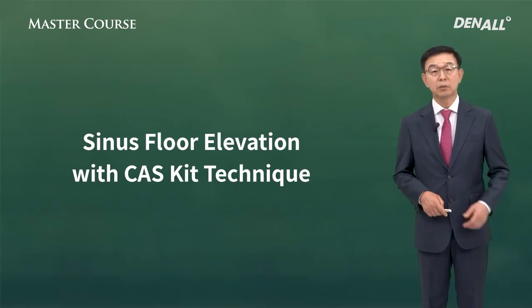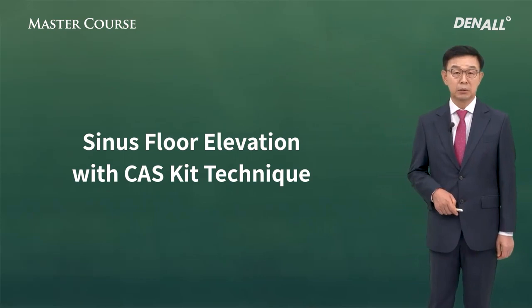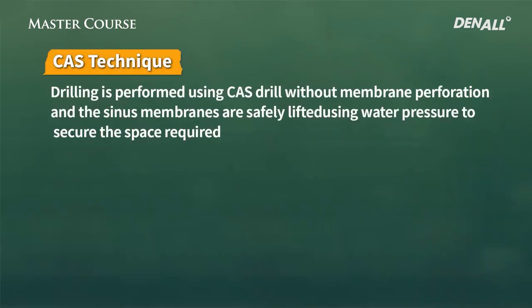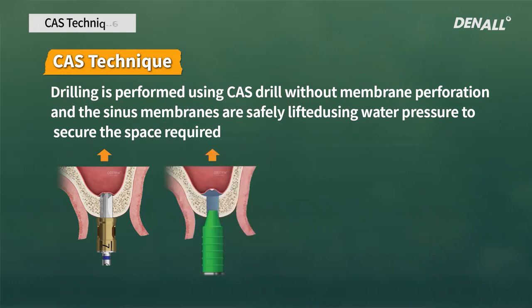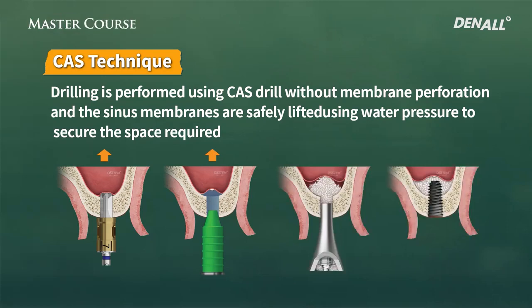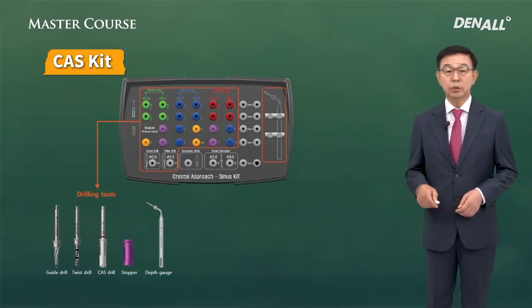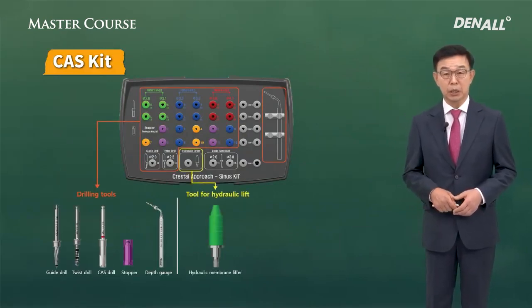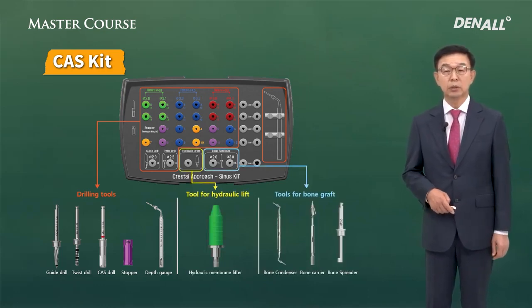The CAS technique which I'm going to mention today is an excellent way to overcome such difficulties. The CAS technique is very simple. Indeed so. The CAS drill is used to do drilling, check the sinus floor, hydrolift, bone graft, and implant placement. This is the composition of the CAS kit. There's a drilling tool, a hydrolift tool, and tools for bone graft. It can be divided into these three categories.